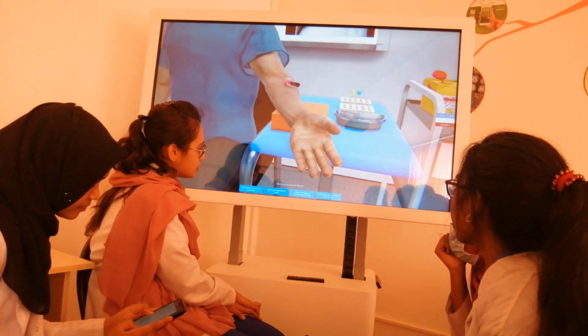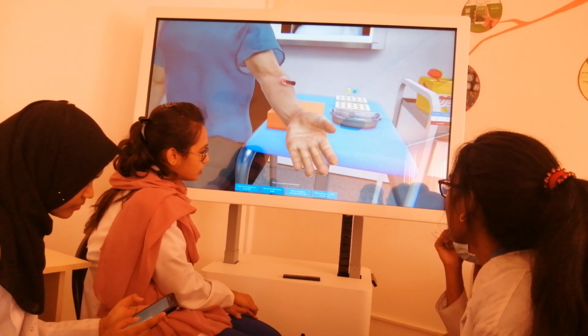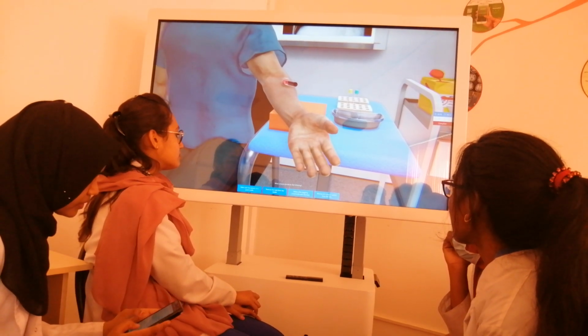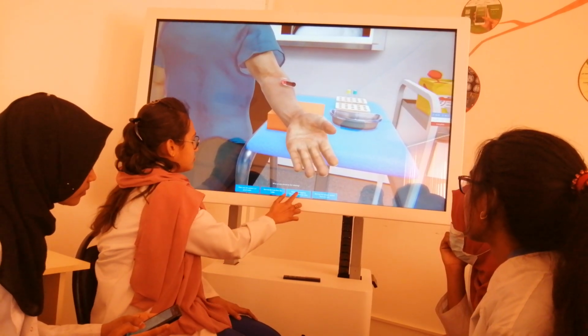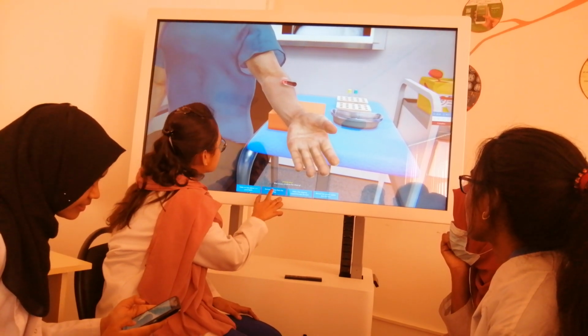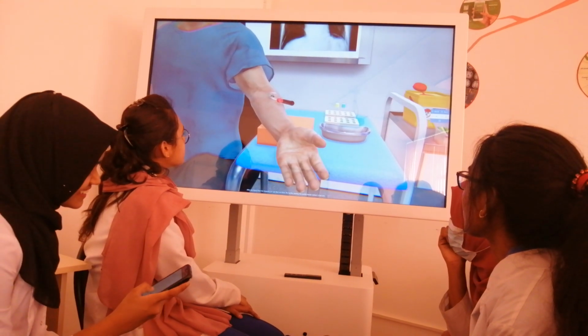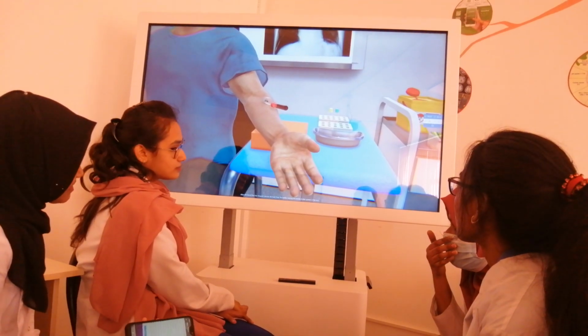Remove the test tube from the holder. Make a few wiggling movements with the tube. Remove the vacuum system from the vein. Make a few wiggling movements with the tube. Untimely action. Remove the tube from the holder. After the blood flow has stopped, remove the tube from the holder, leaving the needle holder system in the vein.